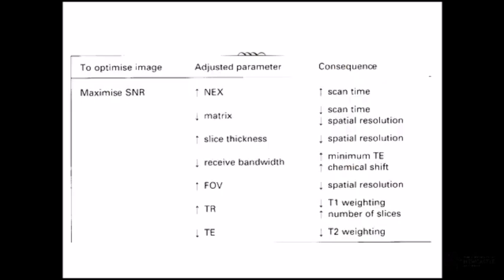Okay, and again, just a table there to give you an idea of how all these factors affect each other. If we change our NEX, we change our scan time. We change our matrix, we can change our scan time and our resolution, etc.